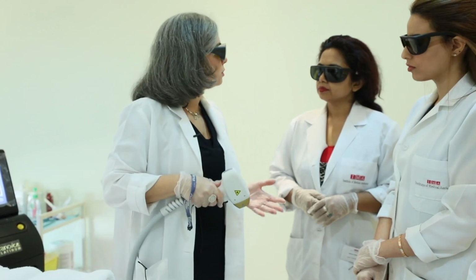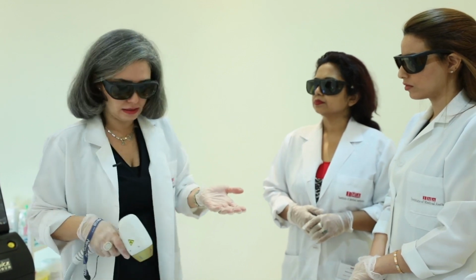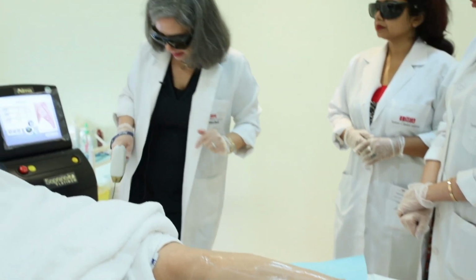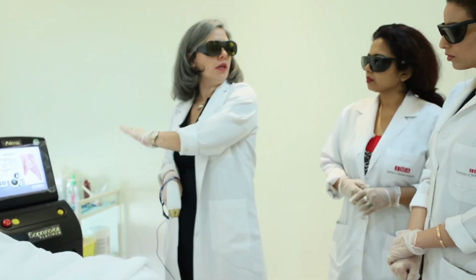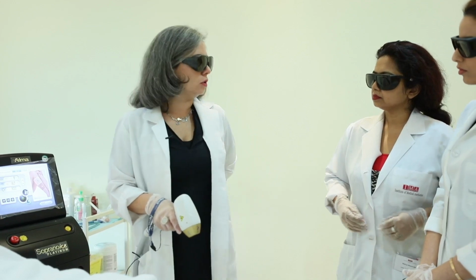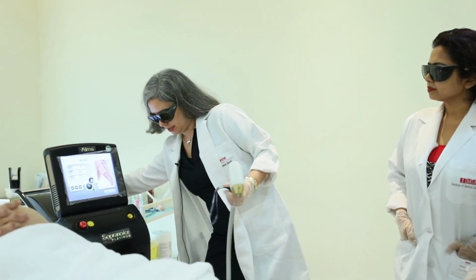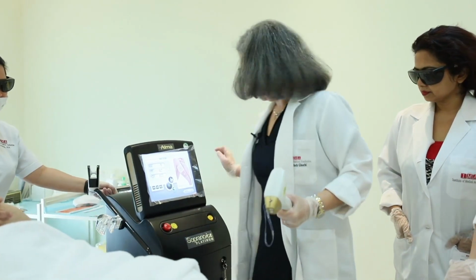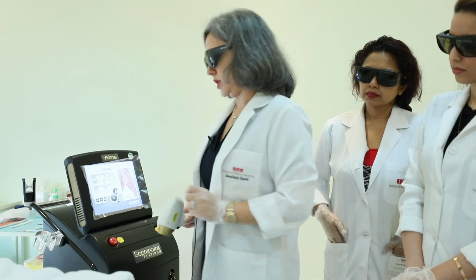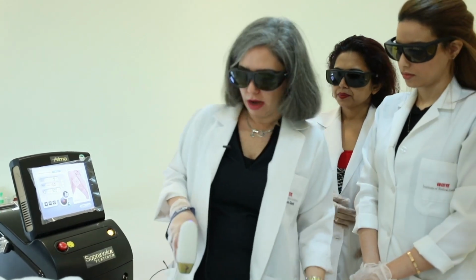Plus, this laser works on motion. It means since the laser acts faster than our brain can assess, I have to start motion before I start my laser. The last thing you do when you want to do the laser is putting your laser on ready. You have to prepare all the environment, gel, patient's position, your back. Once everything is fine and you are comfortable, then you put your laser on ready. So are you ready, Miss Raquel? You might feel slight heat only. If the heat you are feeling is more than usual, just let me know. Any sensation you have, let me know.